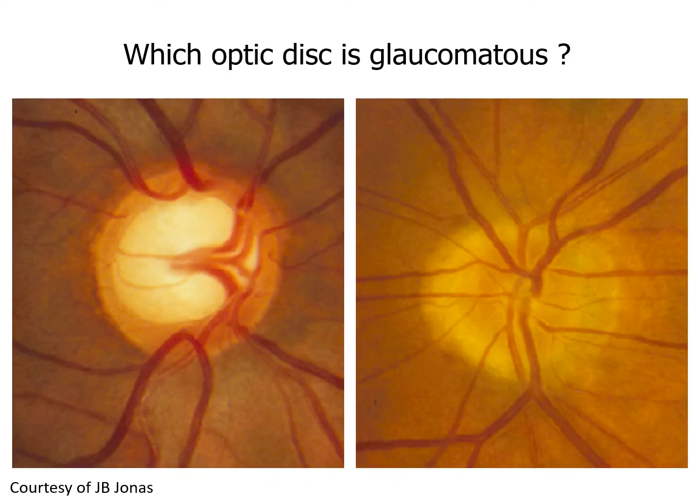Another example, perhaps a little more difficult. This is a medium-large disc. The rim is present in all the sectors. There is a large excavation.